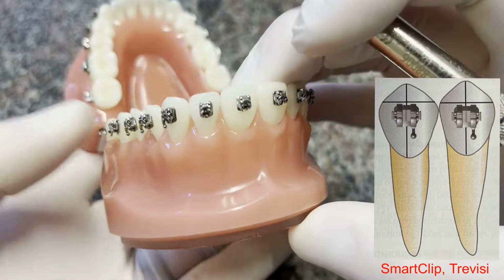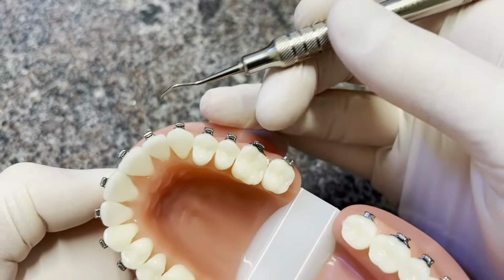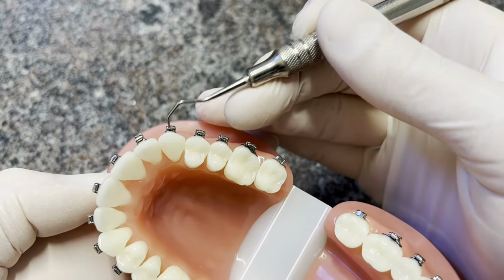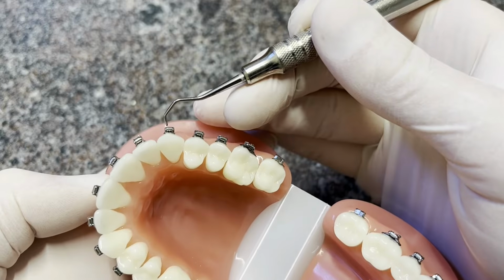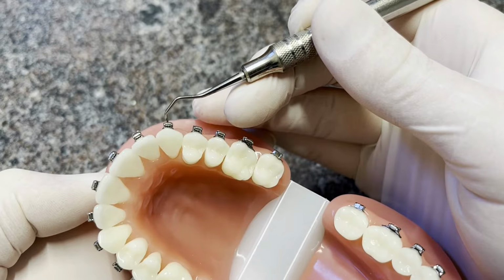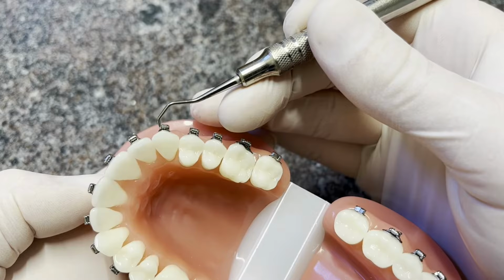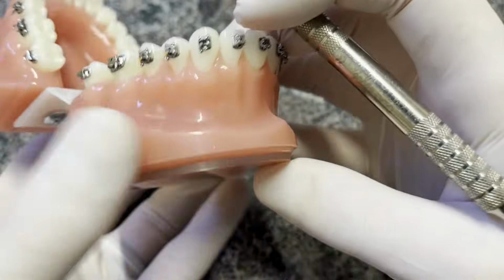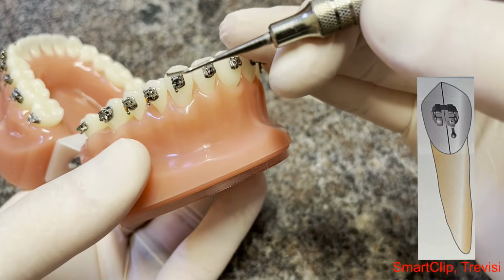So that's premolars. Canines, on the upper and lower, they have a height of contour as well. You'll see kind of a swell here. You want the canines to be just maybe 0.5 millimeter to the mesial of that height of contour. This bracket is just slightly distal to that height of contour. I would rotate this around just a hair so that the center of that bracket was just mesial to that height of contour. And then you'll visualize a line that goes straight down the long axis of the tooth.